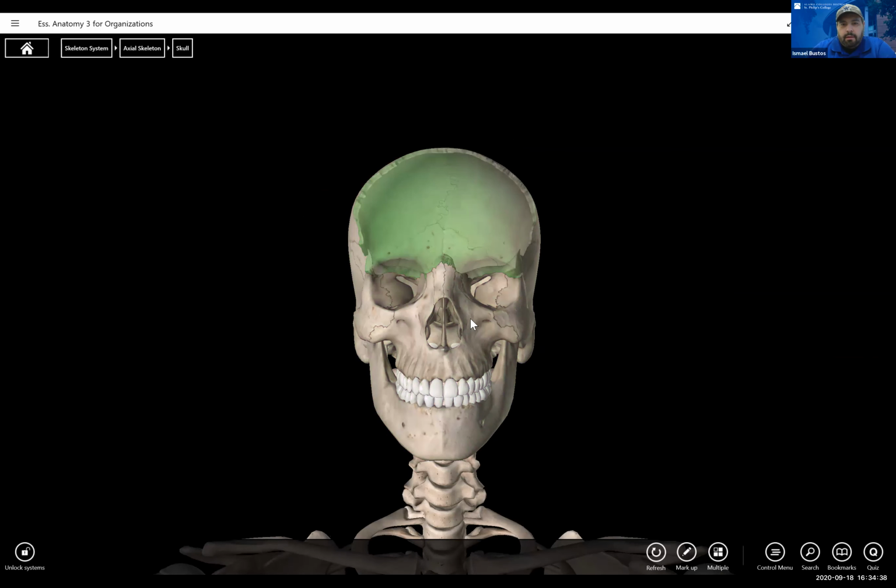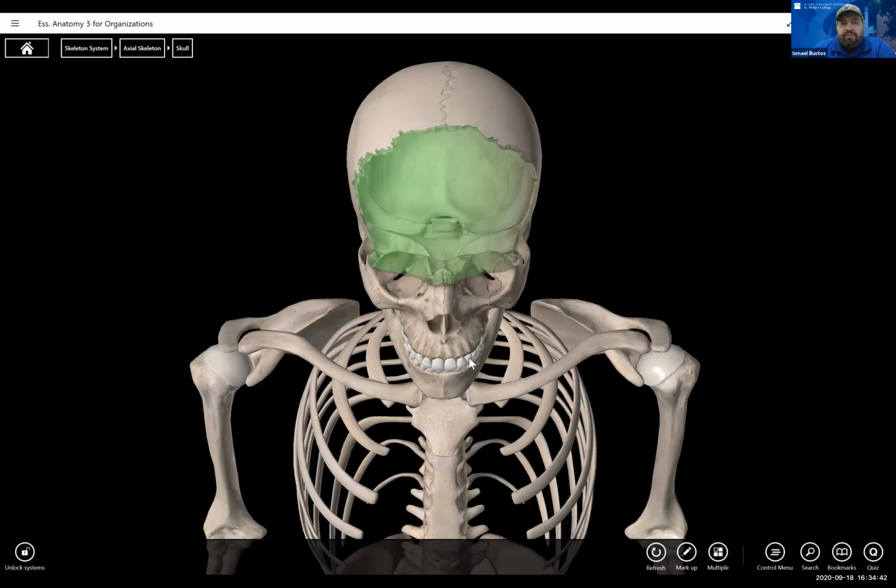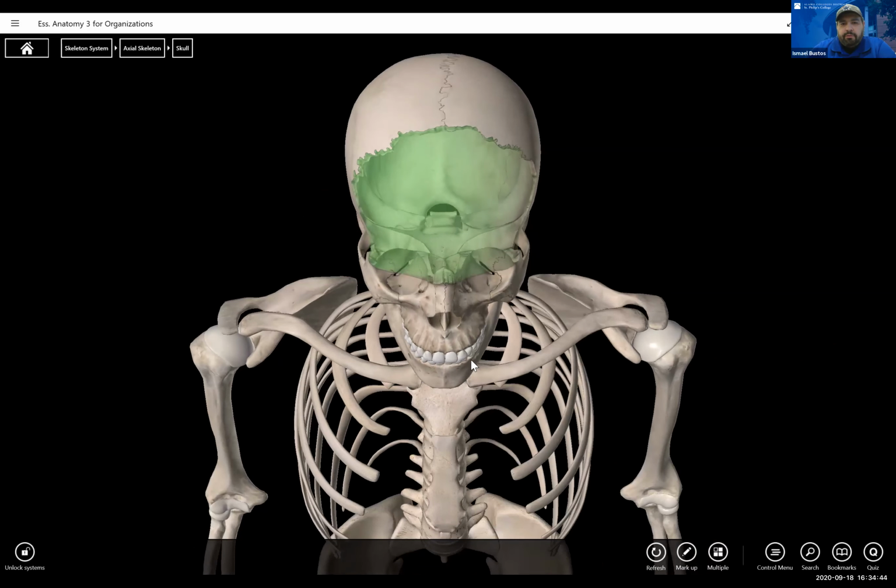All right. So on a normal projection, pretend you're the CR, right, and you're angled 30 degrees to the OML. So you're looking down, the patient's laying down. You're the CR looking down. All right, this is what you would see on your image receptor. You'd see that dorsum sellae, which is that little green structure right there inside the foramen magnum.